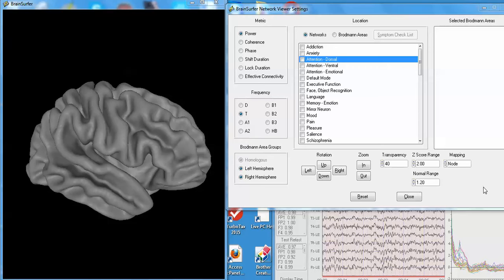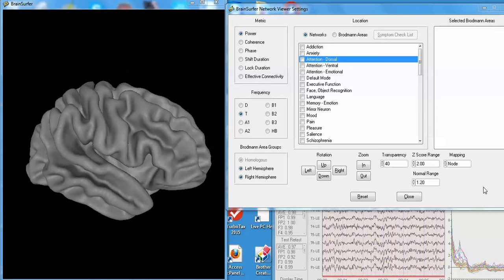Step one, of course, is to record the EEG or import the EEG from a patient's recording, and then eliminate artifact using one of the tools inside of NeuroGuide for artifact deletion. Then scan the record to make sure that there is no artifact selected and that the test-retest reliability is 0.9 and higher.